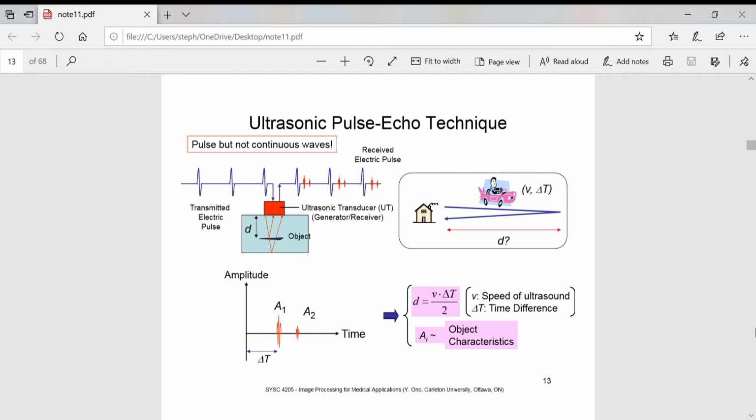The time evolution of the amplitude of the received pulse is defined by the sound attenuation. Both the ultrasound velocity and attenuation are intrinsic properties of the material and can be changed only by varying some external parameters such as temperature, magnetic field, or pressure.